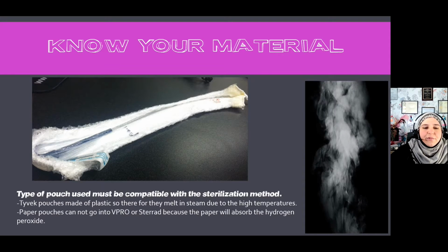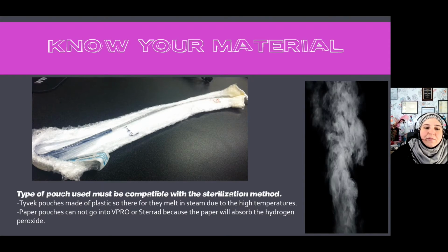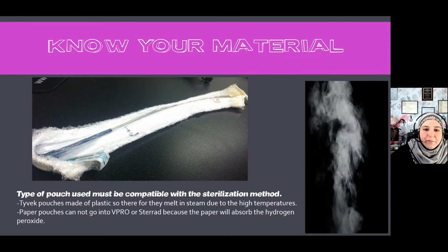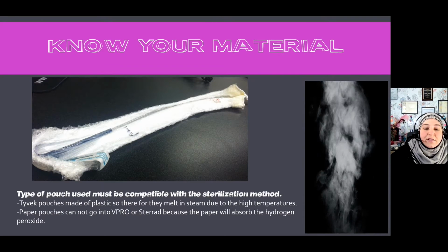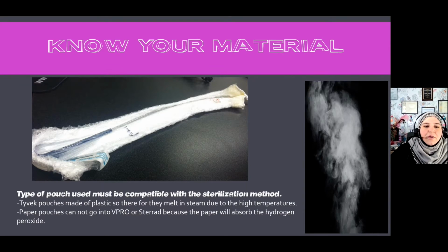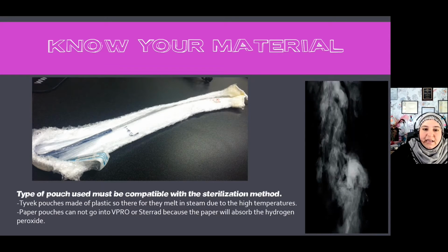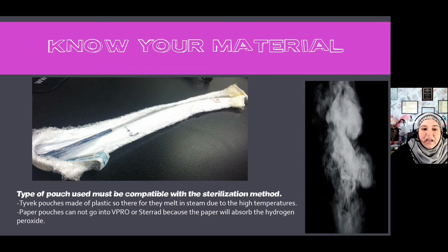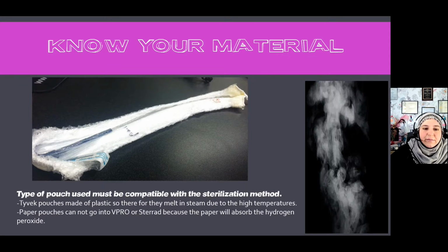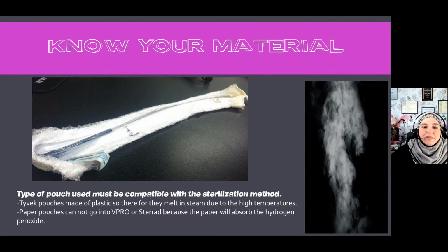And so this is really hard sometimes to get off the instrument, depending on the actual instrument that was in the pouch. So making sure you know, okay, Tyvek is plastic material. I cannot put that into steam because heat would melt plastic, right? And on the flip side, I cannot take a paper pouch and put it into V-PRO or STERRAD. Why? Because we know paper doesn't go into those machines. The reason for that is because it absorbs the sterilant, which is the hydrogen peroxide. If it absorbs the hydrogen peroxide, there's none left for the sterilization to happen. So we want to make sure that we are paying attention to the material that we're using for the items we're processing.